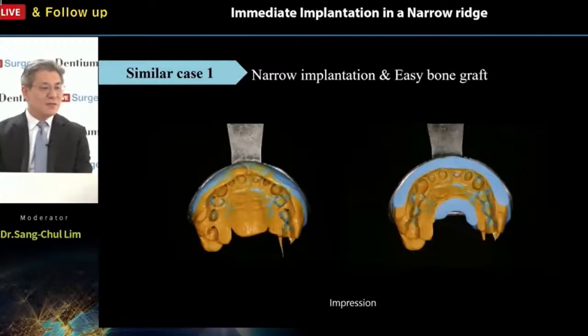So the final impression is always taken by the BTS technique, from the Dentium concept, right? As you know, the Dentium concept is intraoral scanner for the PMMA temporary provisional, and BTS for the final restoration. Why? BTS is more accurate than the intraoral scanning data, especially in long-span cases, actually curvature cases. We always see a more accurate outcome from this BTS technique.